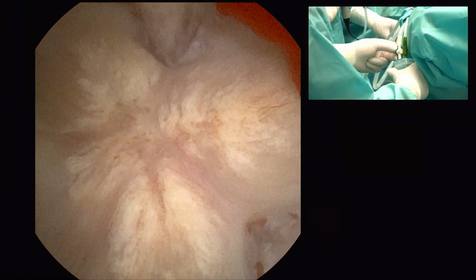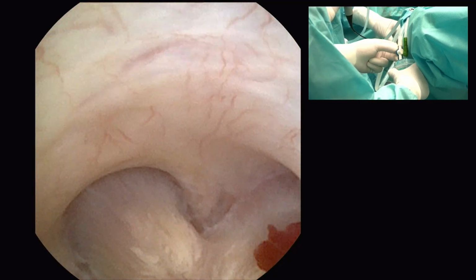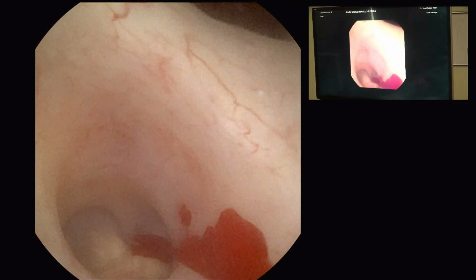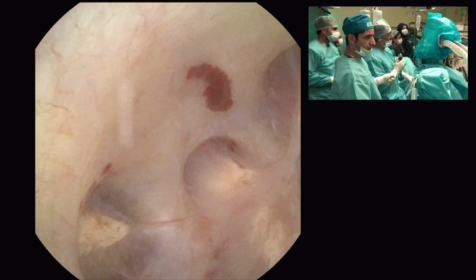Right. So these plaques are there always. So these are the patients we have seen for a long period of time because of doing so many RIRS. These patients usually form stones in the long run. So this is the upper calyx. Do you do something for these renal plaques also? Or nothing, just wait and watch?